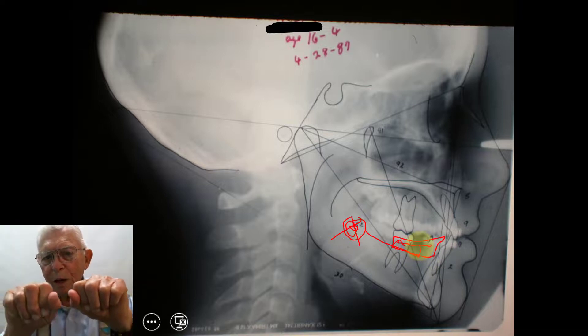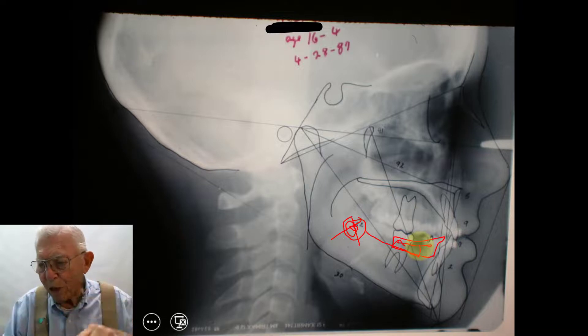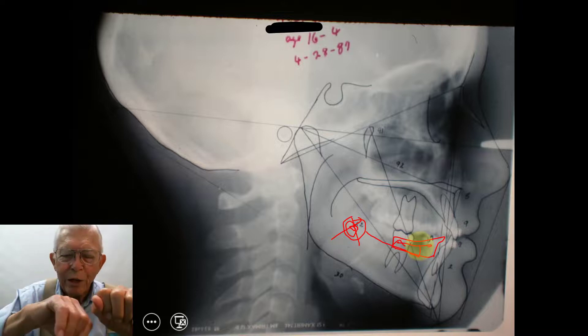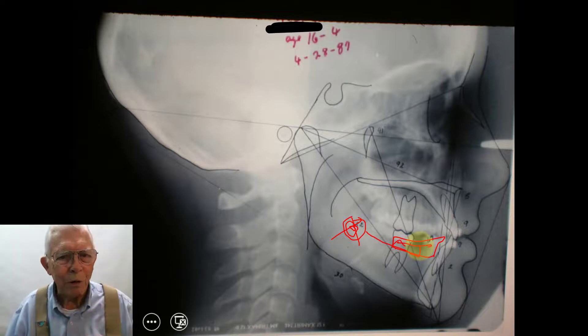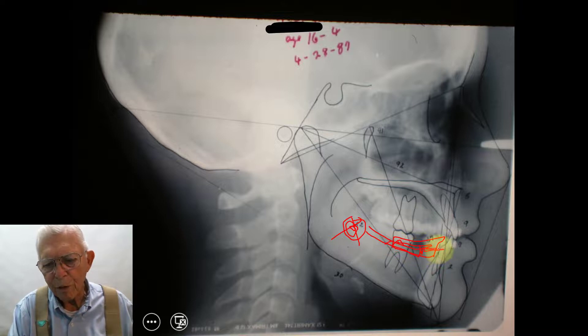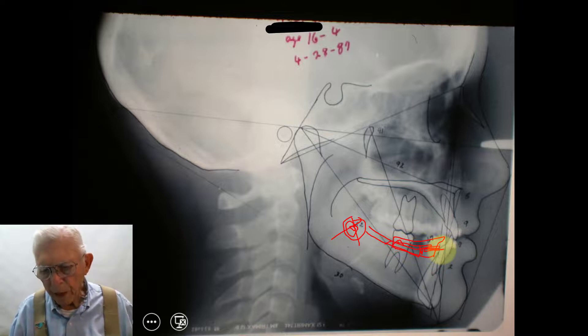Normally when you move the molar forward, the wisdom tooth would upright in that direction, but instead this one just lay down. You can still upright those teeth — even if the roots are higher than the crown, you can uncover the crown a little bit. She's 16 years old and she chose to have her natural teeth rather than bridges. When we moved these teeth forward, we had to hold the anterior teeth in place. I could have used TADs for that, but I didn't at the time.